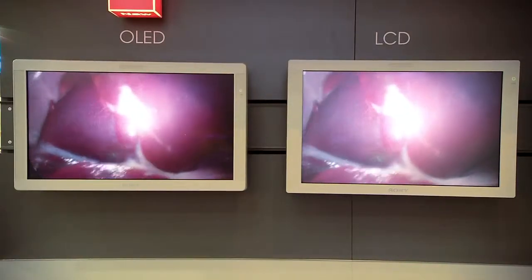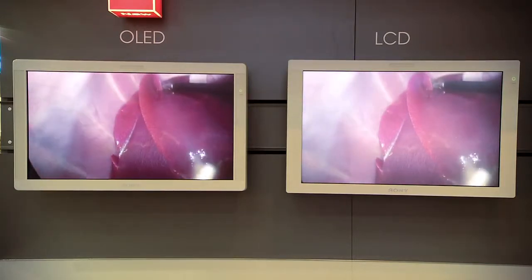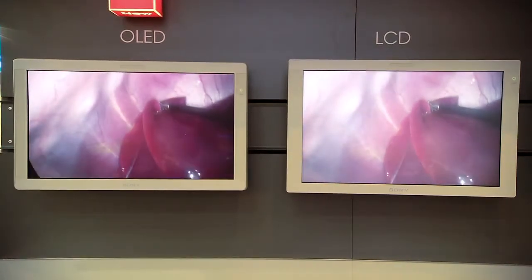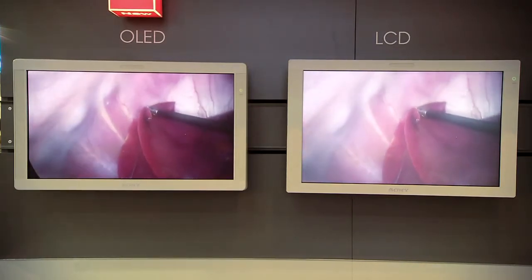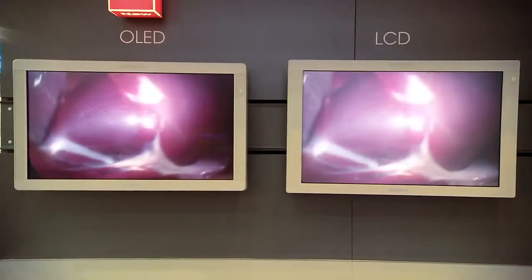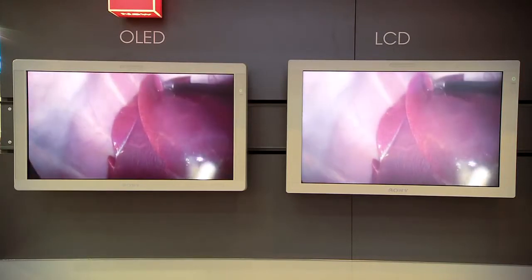A further advantage of OLED is the dynamic range, which means how well details can be seen in extremely dark and also in extremely bright situations. LCD screens do not respond to low light intensity very quickly. Therefore, the colours in dark image areas look pale or washed out. The OLED monitor will show a wider spectrum of colour even at the lowest light intensity. In fact, just as good as it is captured from the camera.